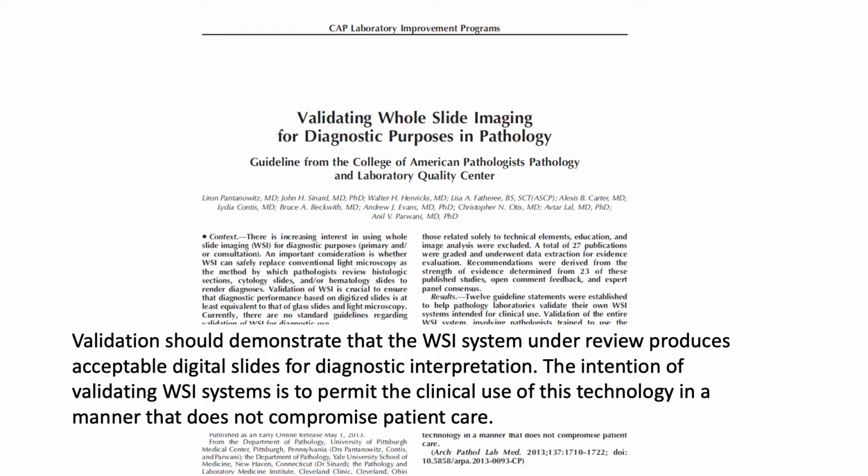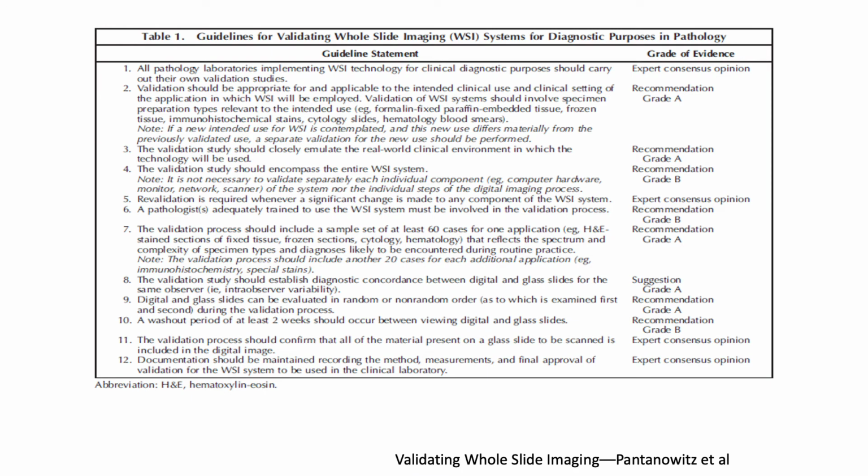The intention of validating WSI systems is to permit the clinical use of this technology in a manner that does not compromise patient care. This table from the publication shows 12 guidelines of validating whole slide imaging systems for diagnostic purposes in pathology. I would highlight a few of them.